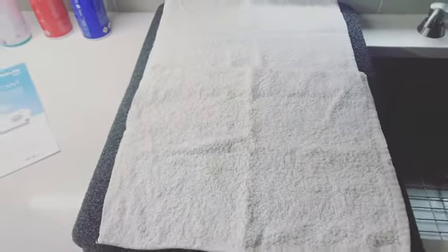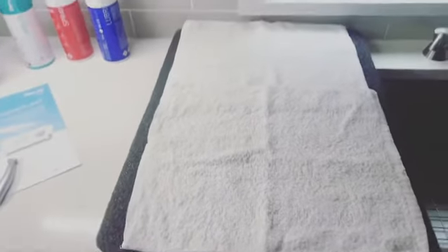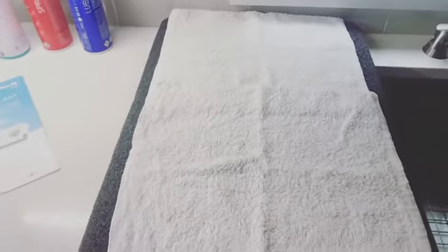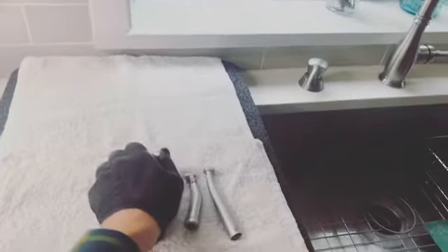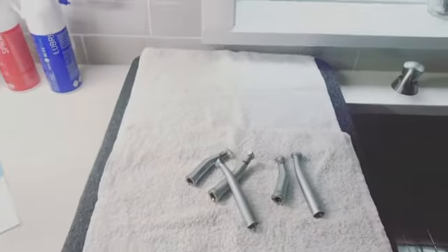So here we are in our sterilization room, and look — we have some padding with some towels. This gives you a soft surface to place your hand pieces. It's recommended to put some padding and/or towels wherever you may place your hand pieces.